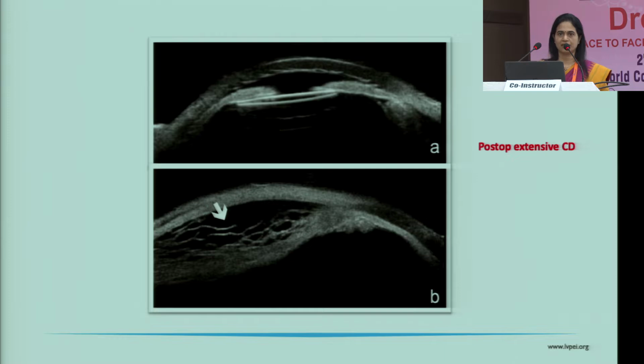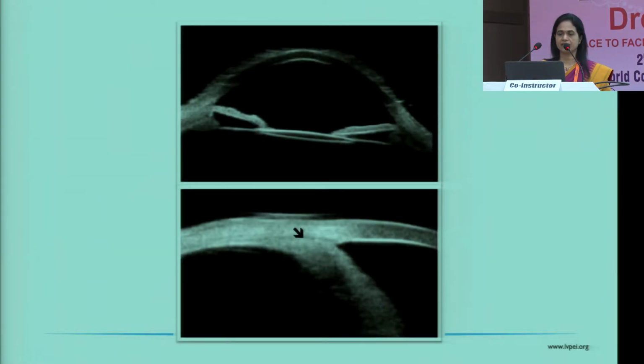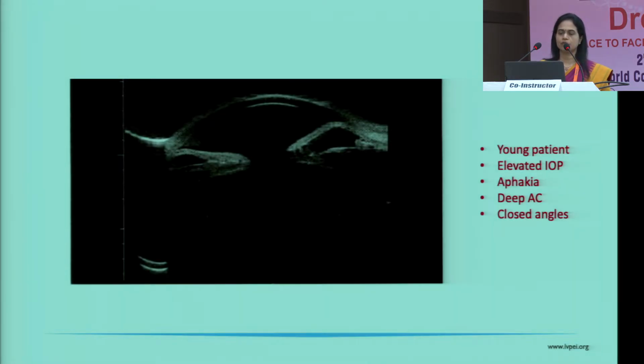In fact, clinically, when the retina surgeon saw it, he said, this looks very abnormal. I think we are dealing with a chronic endophthalmitis. But this patient had a CD with extensive inflammatory membranes. This patient required steroids, and after that it completely resolved. And you can see that everything became as if nothing had happened to this eye. So sometimes it also helps to interpret.